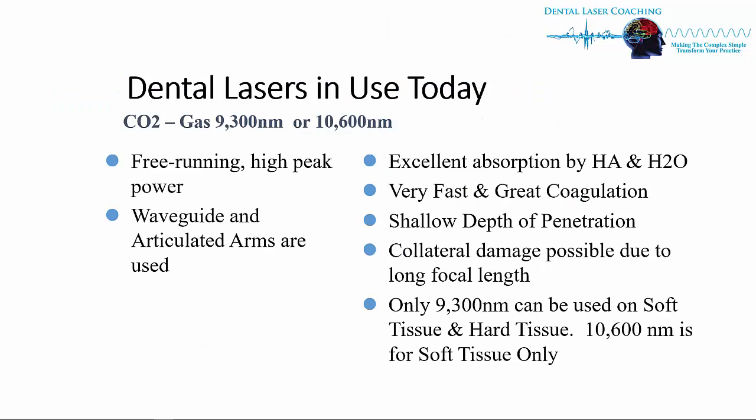And then finally, the last type of laser in dentistry is a CO2 laser. These are free running, again, a complicated mechanism, a little bit more expensive. These technologies only can use waveguides and articulated arms, not fibers. They have excellent absorption by HA and water. They're very fast. They're great coagulators. They have a shallow depth of penetration, and that's why they're great coagulators.